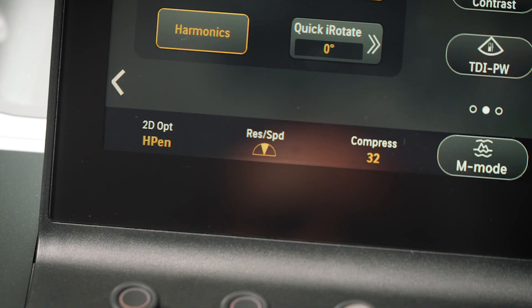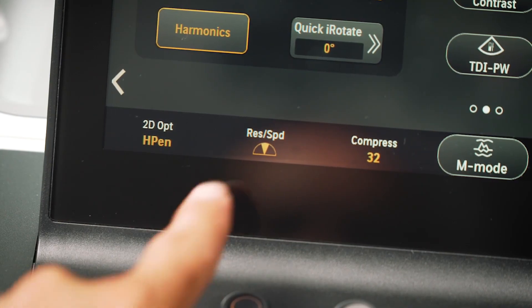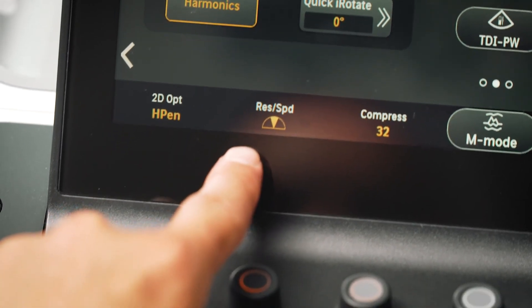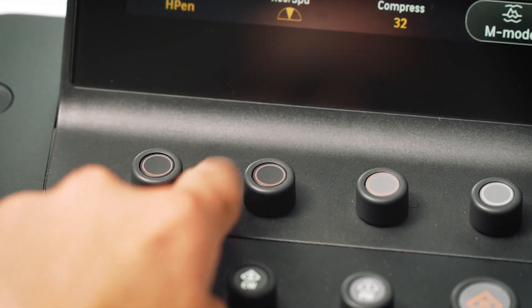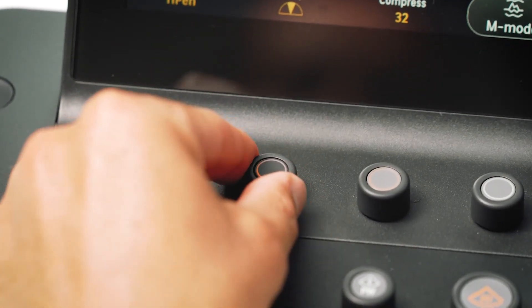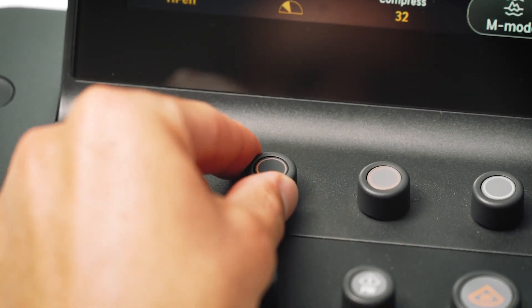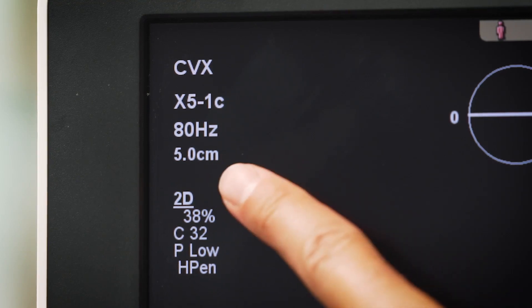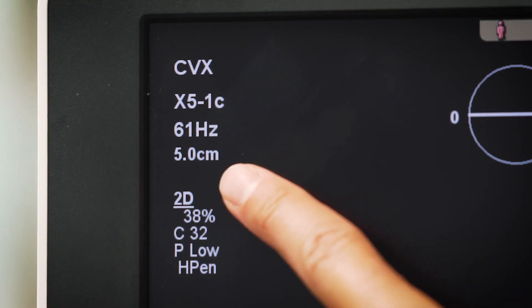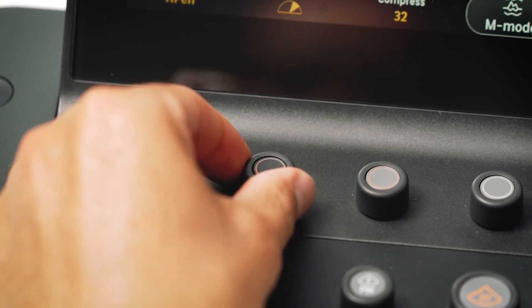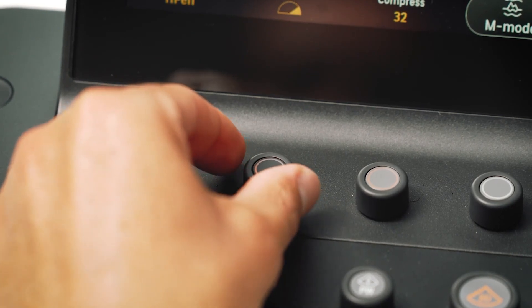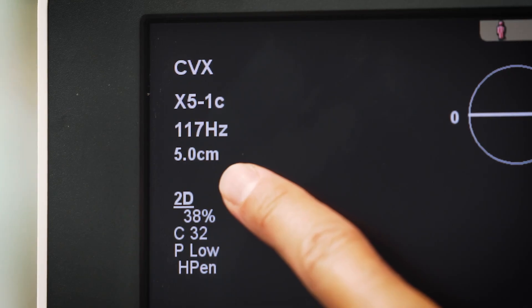The resolution speed rotary key provides optimization of temporal versus lateral resolution. Moving towards resolution increases the lateral resolution and reduces the frame rate. Rotating the dial towards speed progressively increases the frame rate and lowers the lateral resolution.